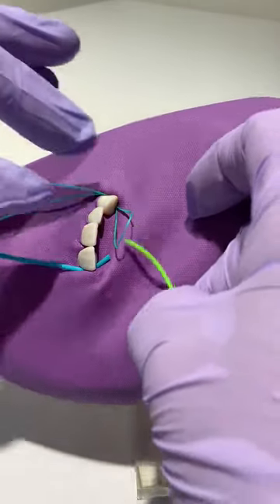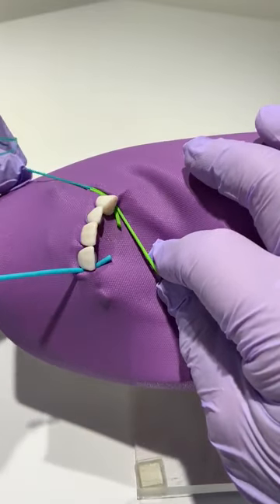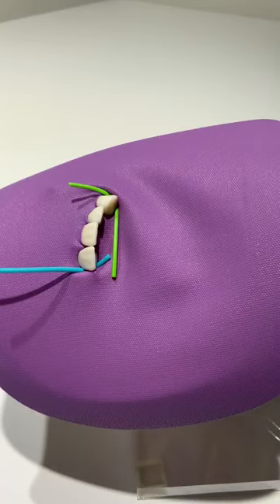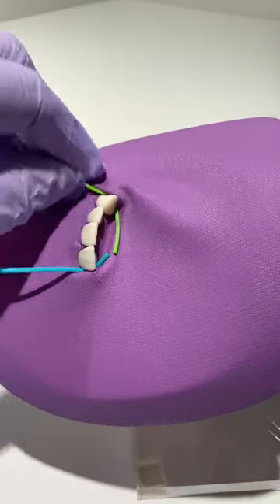Take your Wedget cord, place it through the loop, and fold it over. Pull the two strands of floss. Let go of the short end, hold the long end, and pull the short end through the embrasure. Cut your Wedget cord.